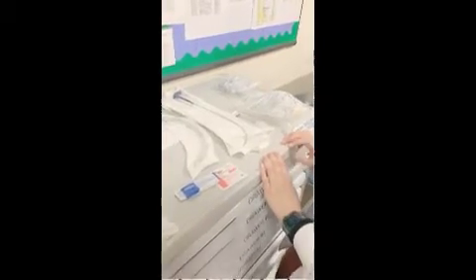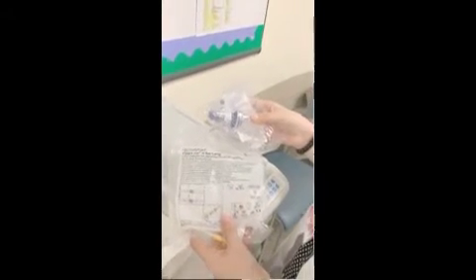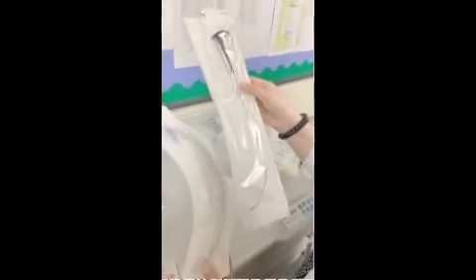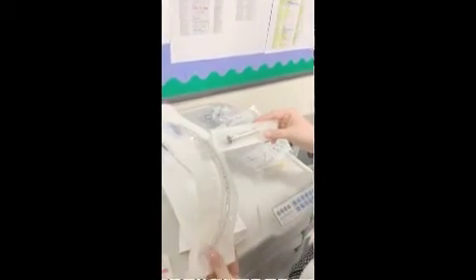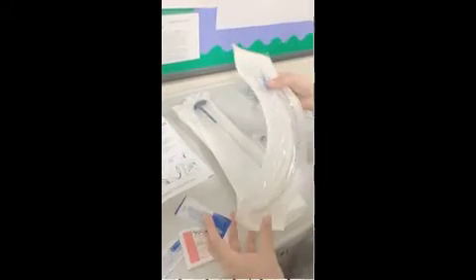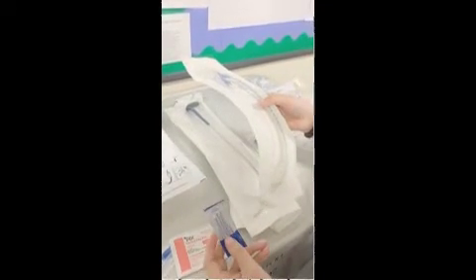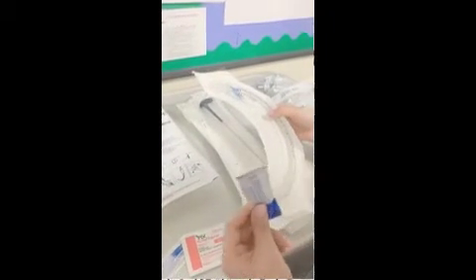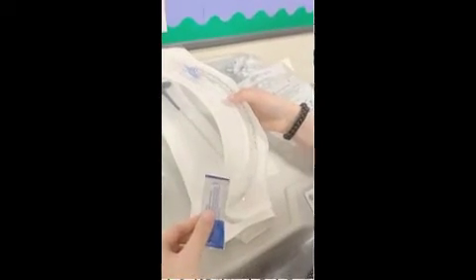airway. First, the resident will pass the waveform capnographer and PEEP valve to the respiratory therapist in the room. Next, the resident will pick the appropriate ET tube size and rigid stylet for video laryngoscopy. She will also choose the appropriate syringe size to test the balloon on the ET tube beforehand. Once these items have been chosen from the airway cart, they will be passed to the intensivist inside the patient's room. We will also include surgical lubricant you can apply to the tip of the ET tube as well.